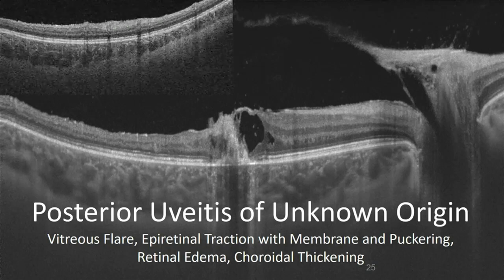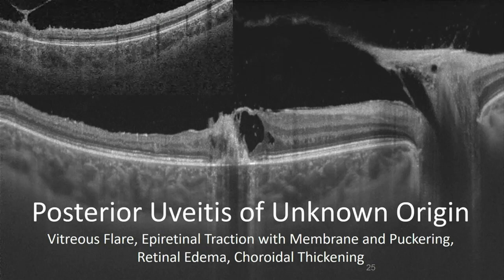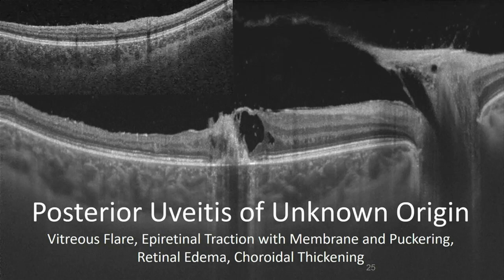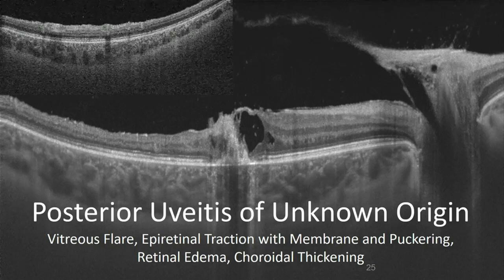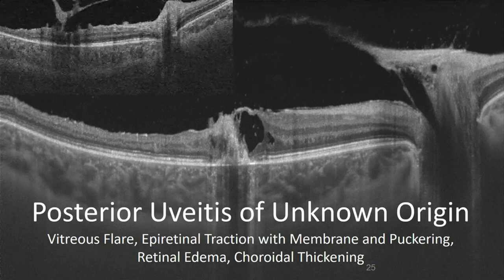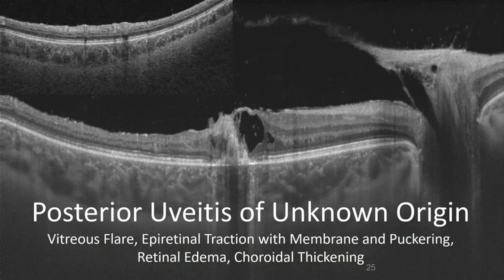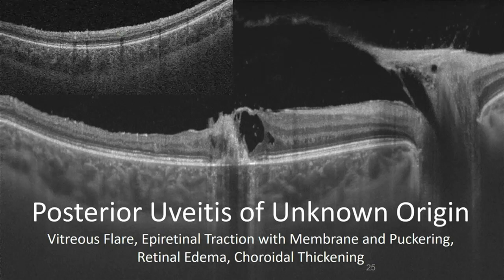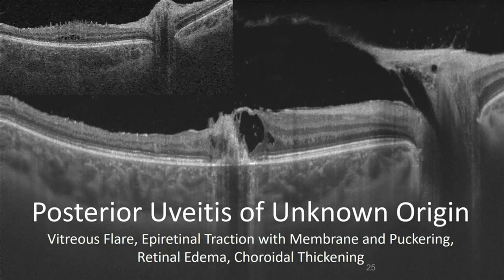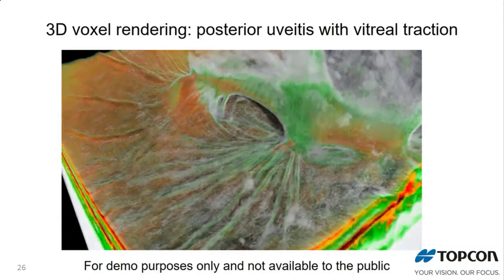Additionally, what I wanted to see was, is it possible inside the data to see the actual cells? Because a lot of times when we're doing uveitis in a clinic, in a hospital, you take your Volk lens and you say, okay, +3, +4, +5. But if you ask 3 residents to do this, you get 4 different answers because it's a very subjective way of doing things. So what I wanted to see was, is any of it visible in the data set?